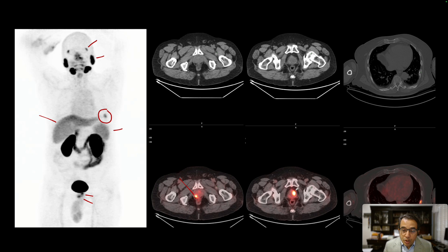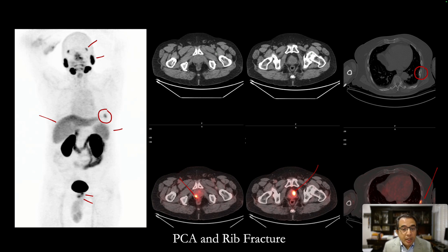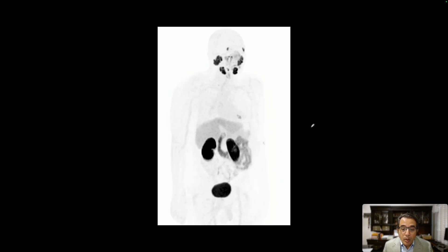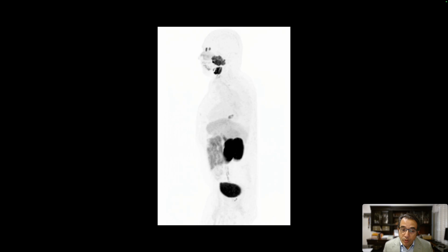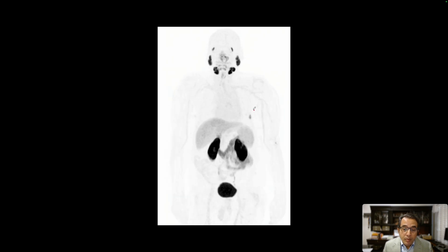The prostate foci and rib focus are shown here, corresponding to a very indeterminate, ill-defined sclerosis on the low-dose CT — which may represent a bone metastasis or a prior fracture. After systemic treatment, a follow-up study shows the prostate foci have resolved, responding to treatment, but the focus in the rib persists. This tells us it is not metastatic disease but probably a prior fracture showing increased PSMA uptake on PET-CT.